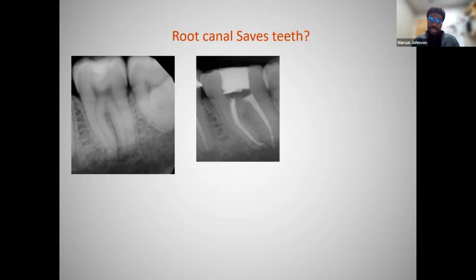Completed the endodontics to what I would say was a standard of practice that's acceptable. You'll look at my access then versus now, but more or less I was able to manage the anatomy, fill and shape the canals, and send the patient on his way to go get a restoration by the general dentist.